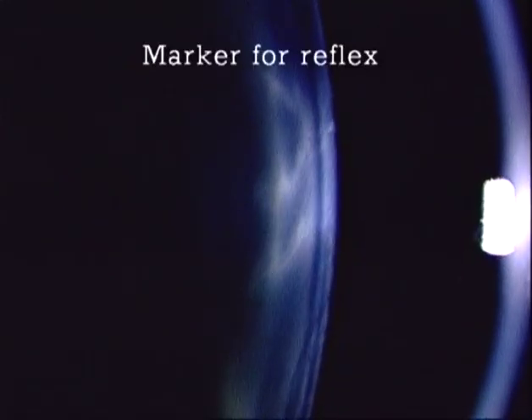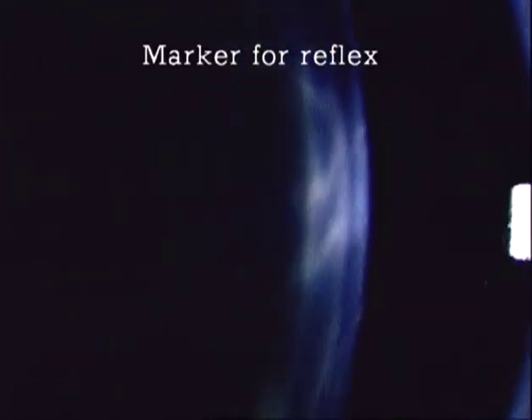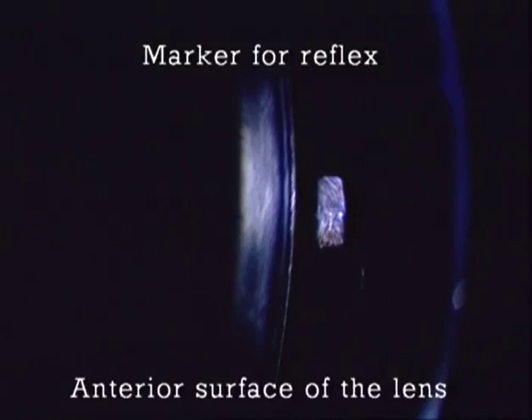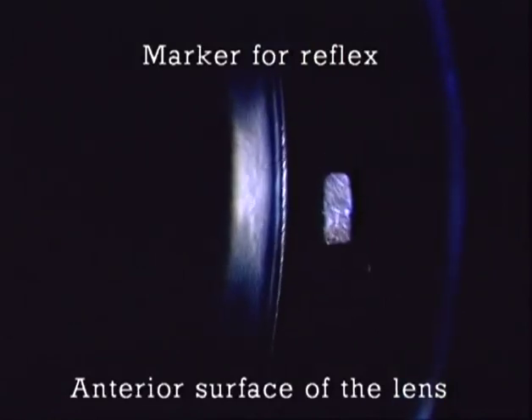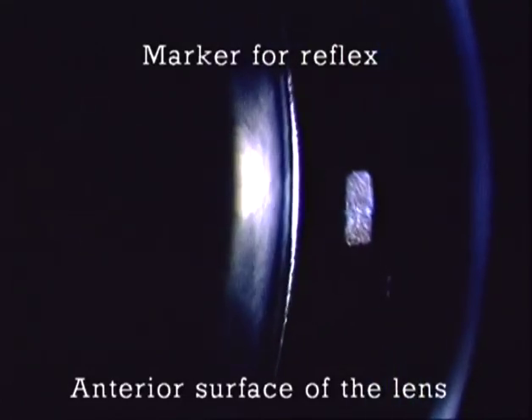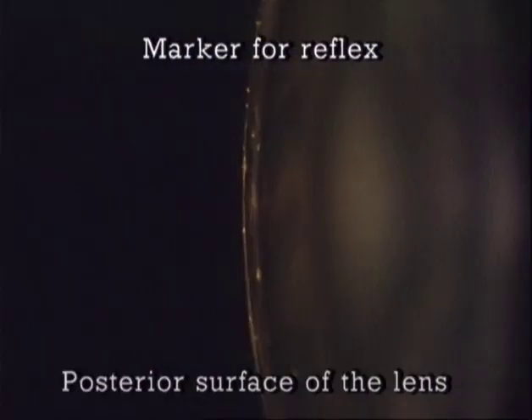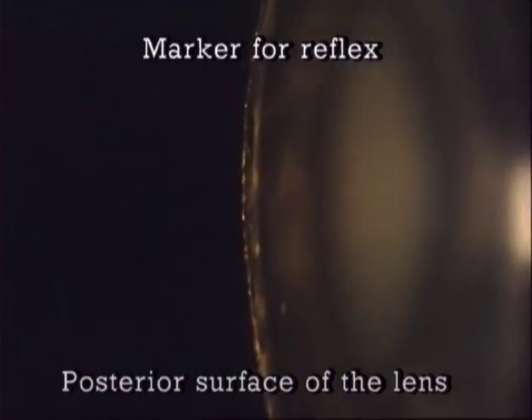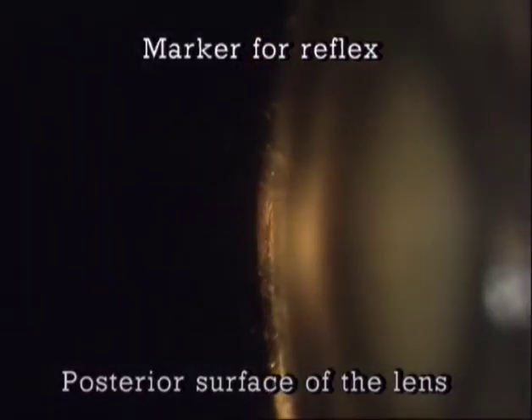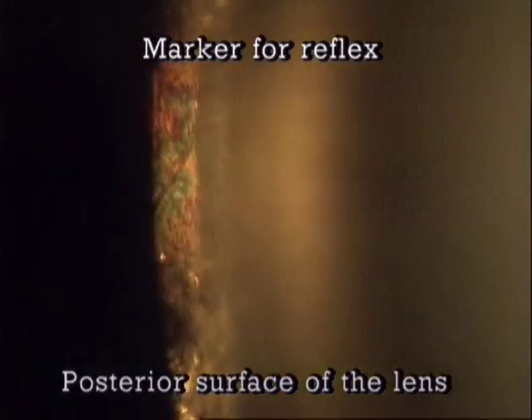In addition, the optical knife as a focus marker can be used for finding the level at which specular reflexes shall be produced. To find this level, for example, at the anterior surface of a lens, first the optical knife is sharply imaged at the anterior surface to distinguish this surface from other surfaces, such as the nucleus. Then the illumination angle is adjusted, and finally the beam is widened to show the specular reflex. Similarly, the posterior specular reflex is sought by first focusing the optical knife at the posterior capsule of the lens. Then, by widening the light beam, the colored reflexes of a beginning subcapsular cataract are revealed, visible even better here at high magnification.